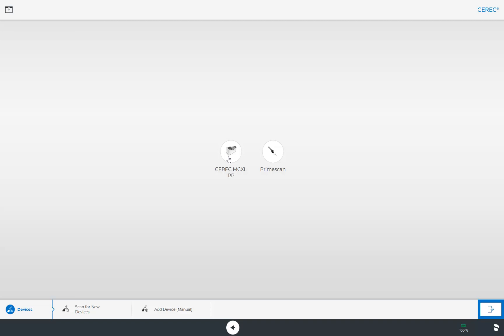In our case, a CEREC MCXL PP and our Primescan are connected. First of all, we select the milling unit.